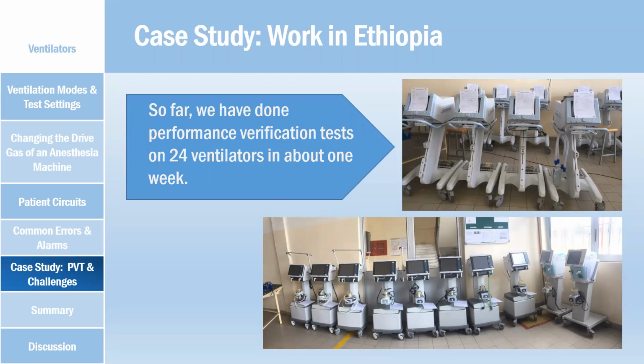They're creating these warehouses where teams and volunteers can come in and do preventive maintenance. They can do corrective maintenance. You can see all the checklists that they're filling out here. They did about 24 ventilators in the first week and a few more since then. But we're going to tell you a little bit about what they've struggled with so far, and what they've done to solve those things. So Guna, I will go ahead and give it back to you.